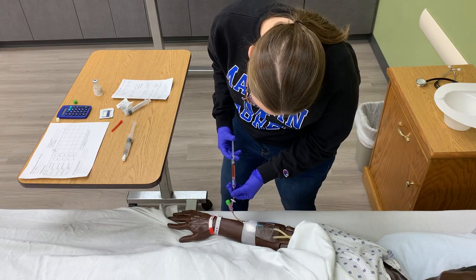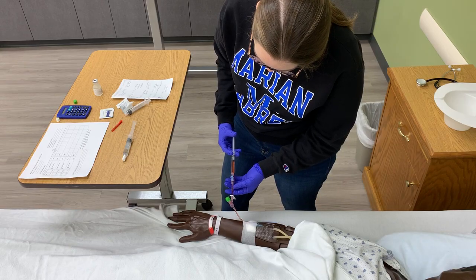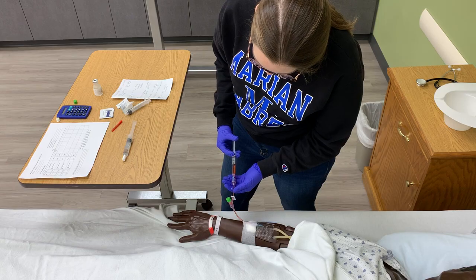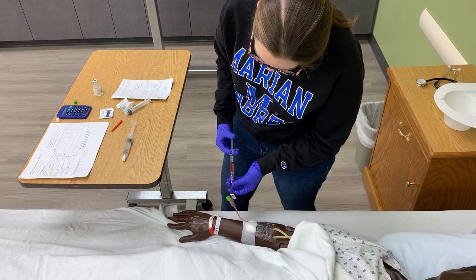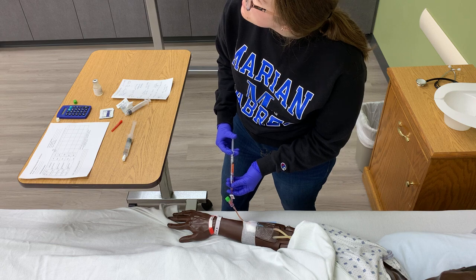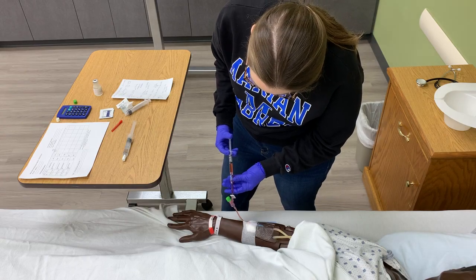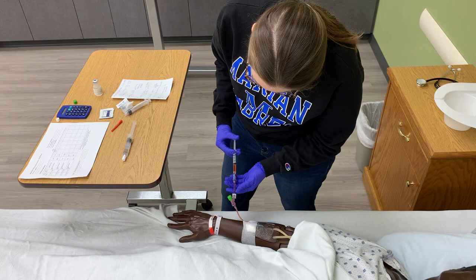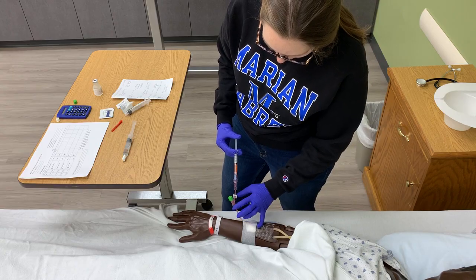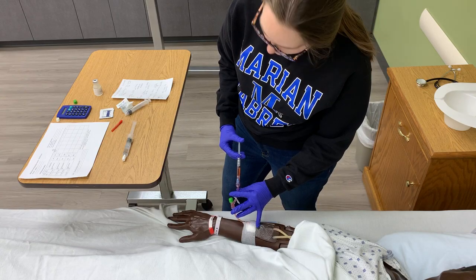Okay, pushing another 0.3. Okay, we're going to push another 0.3. And we're pushing another 0.3.